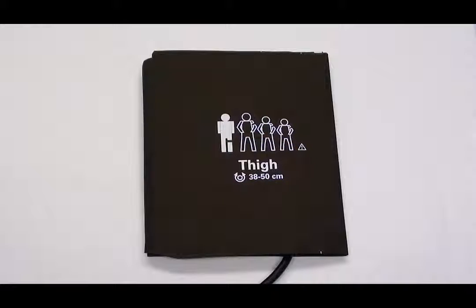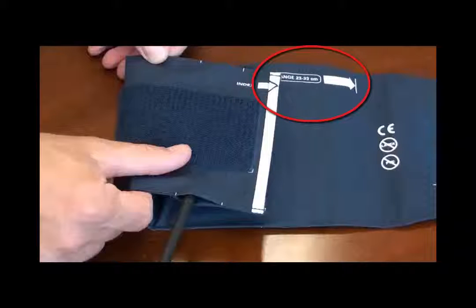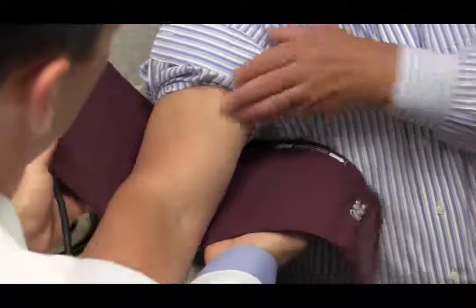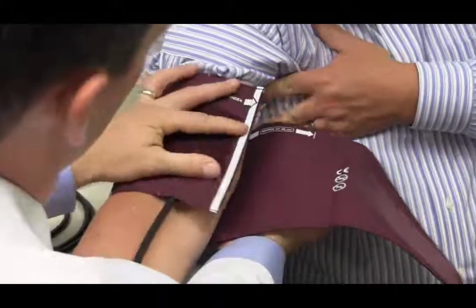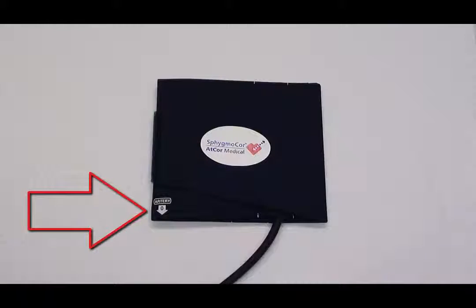On the inside of each cuff, there is an index marker as well as a range indicator. When the cuff is placed on the patient's upper arm, the index marker should fall within the labeled range, indicating the appropriately sized cuff has been selected. An artery marker is displayed on the cuff to ensure proper orientation when placed on the patient's arm.